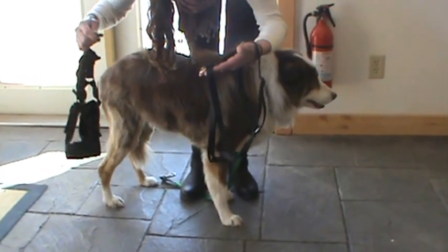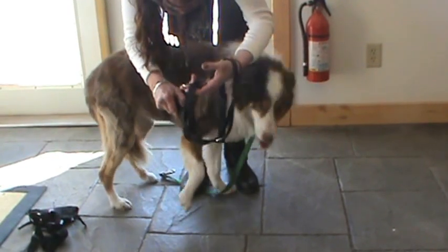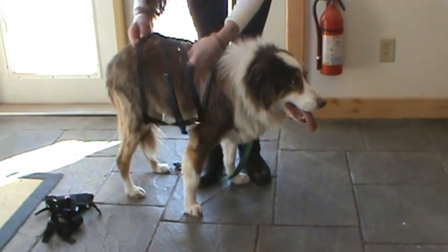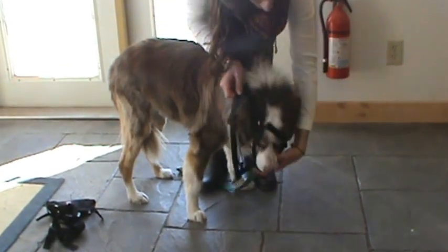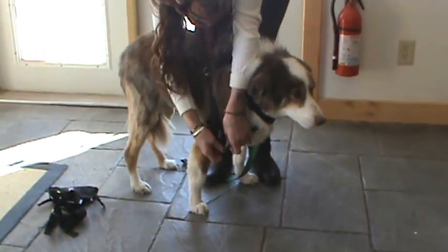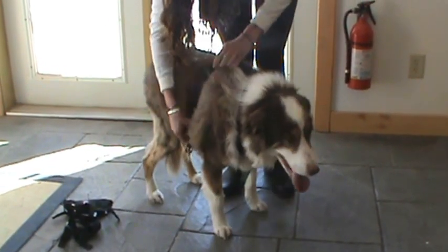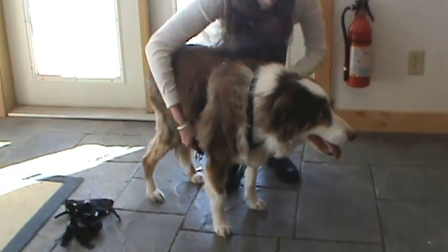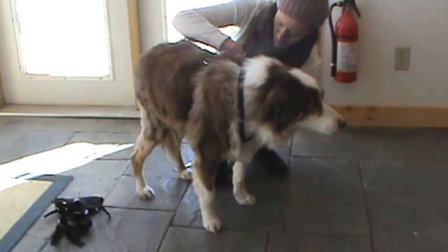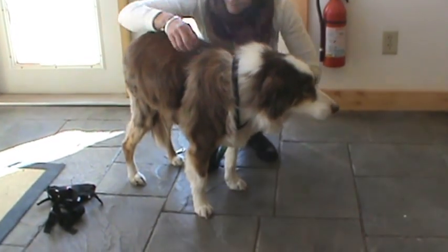Step two is to unbuckle the harness and hold the top D-ring where you put your leash on. Now, you're going to put the big loop over your dog's head, bring it back, and then one front leg has to go through that loop. The harness then goes behind the front legs and hooks with the buckle. Those are all adjustable — if it's too tight, just loosen it up a little bit.